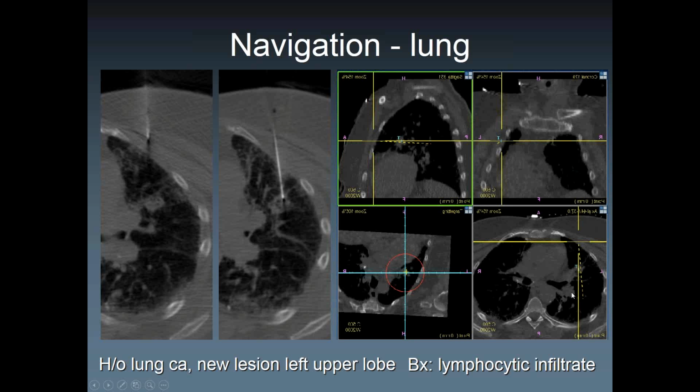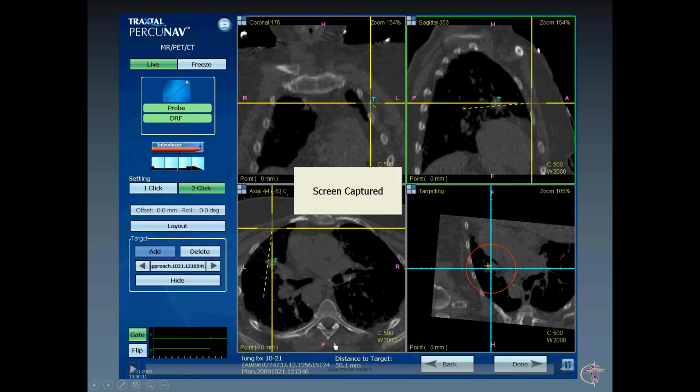So this is all based on the assumption that the patient is not moving, right? It's not breathing. So you have to tell the patient, do not breathe, and then you move the needle based on this saved virtual image. It works sometimes, but it doesn't always work. And it's a lot of work to set it all up. It helps you in some instances, and I'll show you a case where it actually helped quite a bit. So the movie is not running. We tried that, but let's move on to the next.